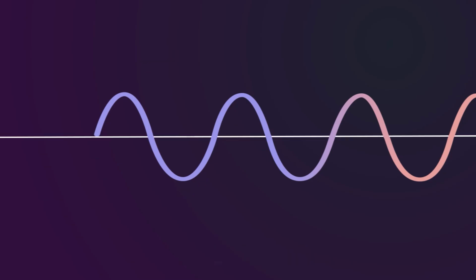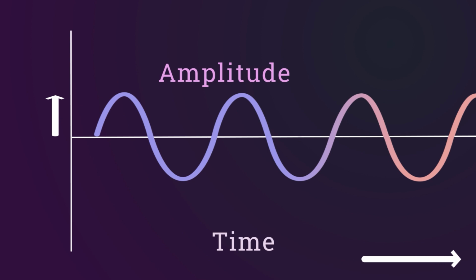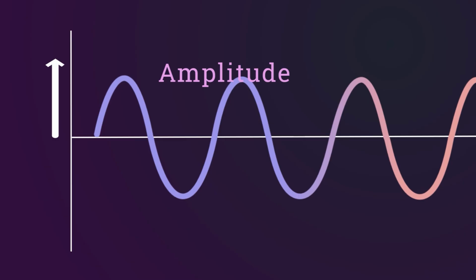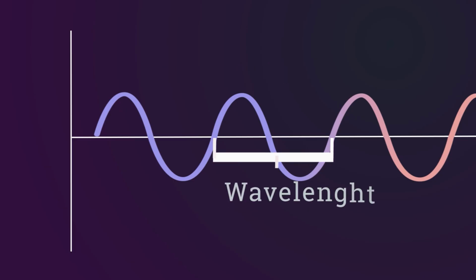Sound waves have 4 physical properties. Amplitude. This is the distance of maximum displacement from the resting position and represents how loud the sound is. Increasing the amplitude increases the acoustic pressure or the pressure generated by the crystals that emit sound. It allows the ultrasound machine to hear a louder return sound signal. Wavelength.